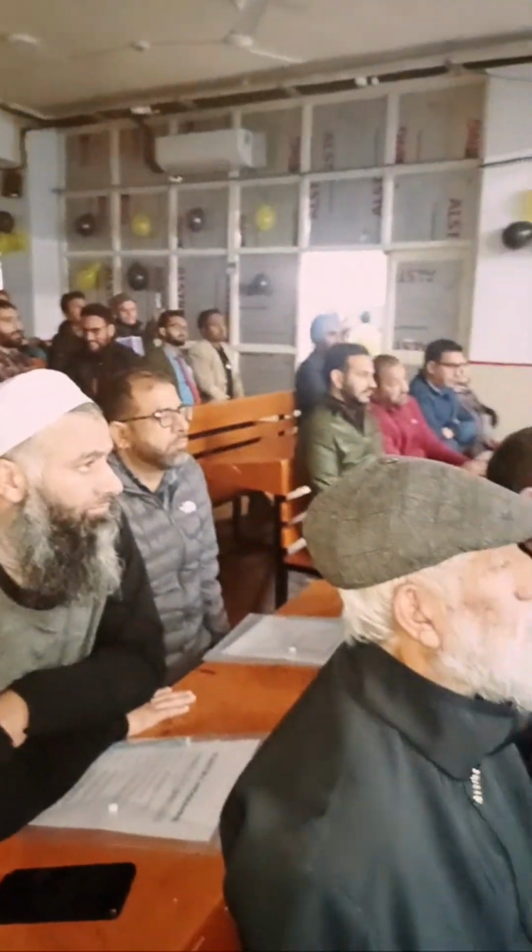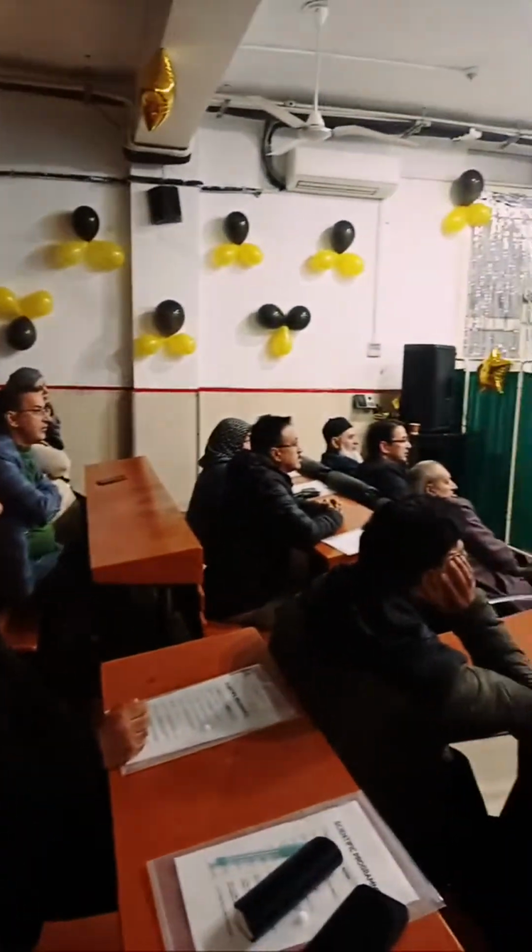I cannot see anything. Can you increase the light?